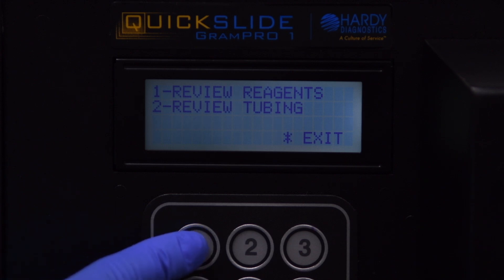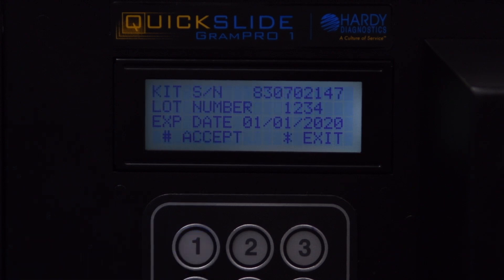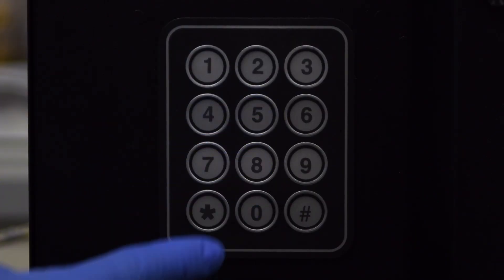Press 1 on the keypad to select Review Reagents. This display will show the current kit's information. Press 1 to select Change Kit. Once the blinking cursor appears next to the kit number, use the keypad to enter the kit number as it reads on the new reagent kit label.